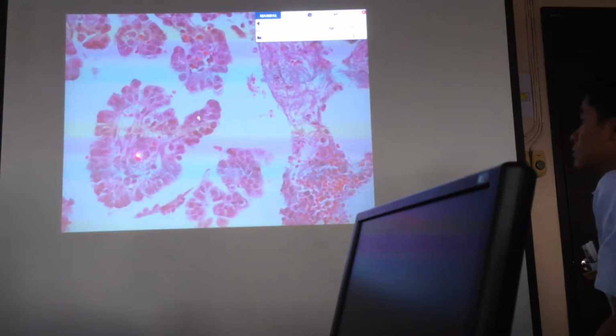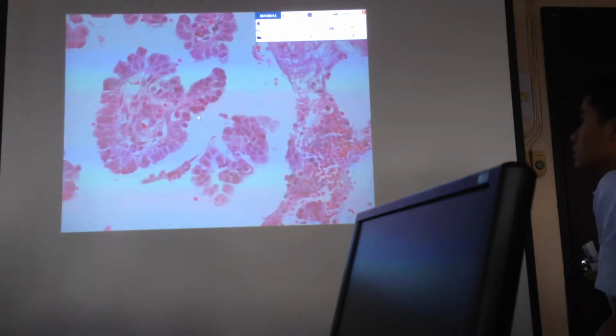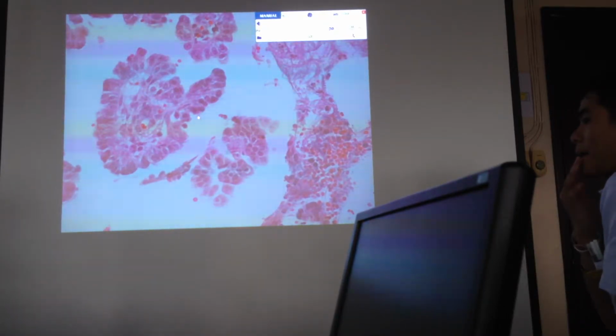This is fibrovascular. Okay, papillary core, and then you have the presence of a fibrovascular structure. Actually this is artifactual. They are not round. When we see them in cross section, they are not round. They are actually like papillary fronds. But when you cut it, they would be cut in the center, and that's the appearance. The papillary excrescences get cut. That's what will happen.